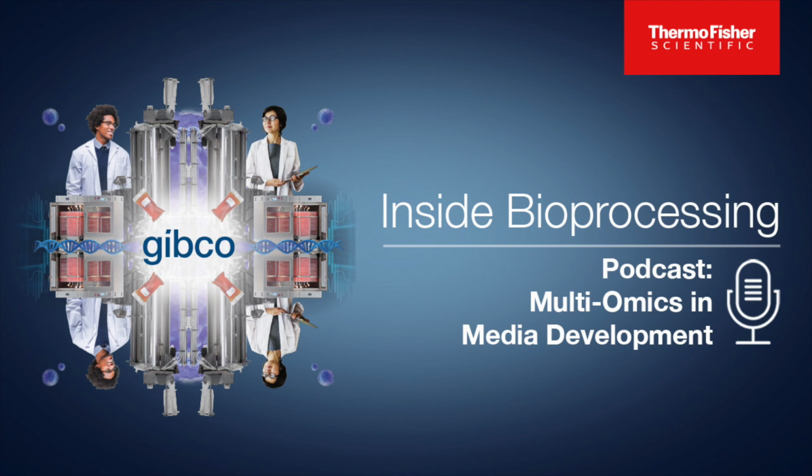But as better technology came along to be able to look at spent media, it became more of a push to look at wholesale amino acids, carbohydrates, those things. And I would say that again began in the 90s with the goal of removing materials such as hydrolysates, and that's where the work really started. Groups were trying to determine what hydrolysates were bringing to the formulation that were causing it to perform well. When you use something like yeast extract or pea hydrolysate, what exactly is contributing to the performance of the cell line? And the goal was really to remove those things because they were relatively undefined. We didn't have a clear understanding of exactly what was in it.